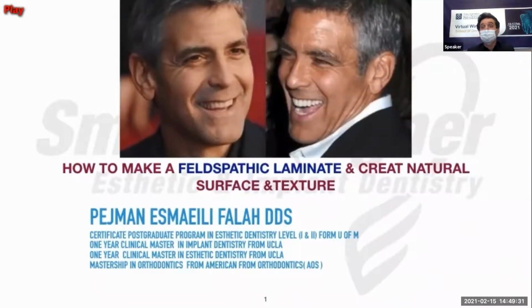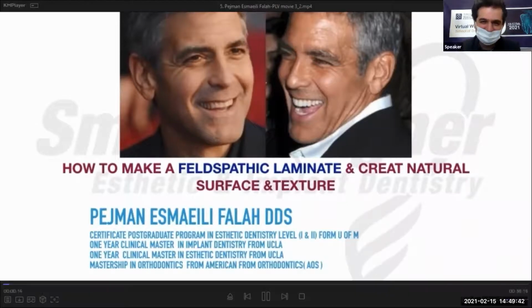Hello, everybody. I hope you are doing well. In this lecture, I am talking about how to make feldspathic laminate veneer in the lab and how to create surface structure on porcelain.